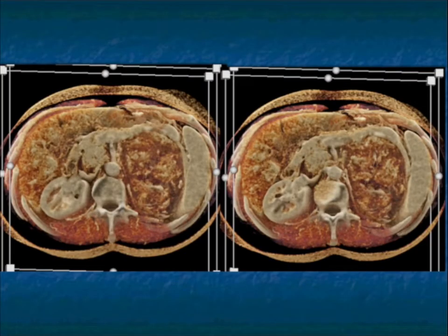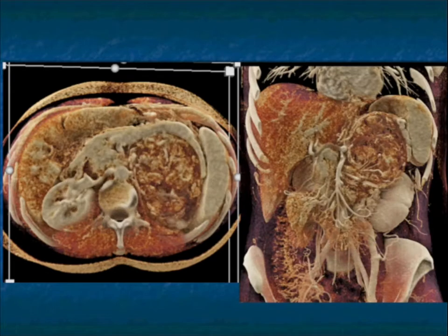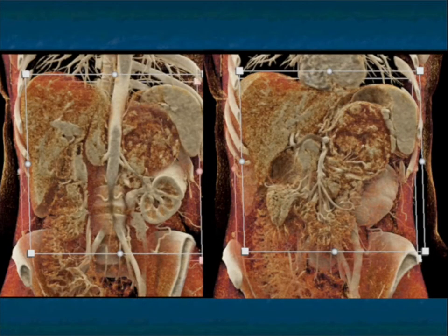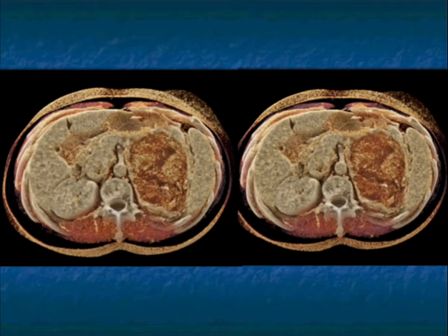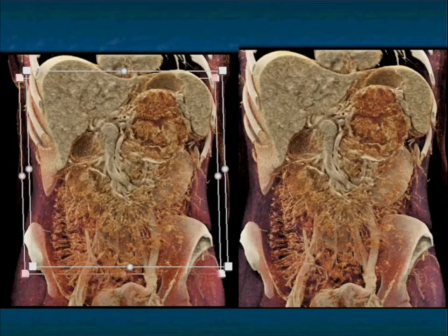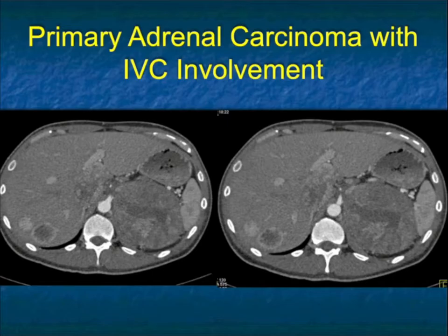Here's a pretty example of that involvement on the cinematic rendering — the necrotic tumor with the neovascularity. You can see the renal vein involvement with the neovascularity in the renal vein as well as in the patient's IVC. And here's a range of cinematic views which also nicely show the markedly dilated left gonadal vein.